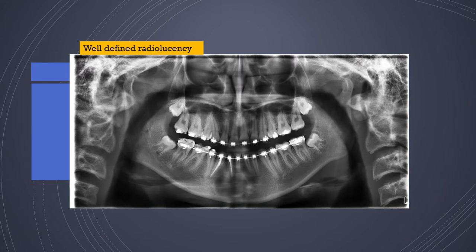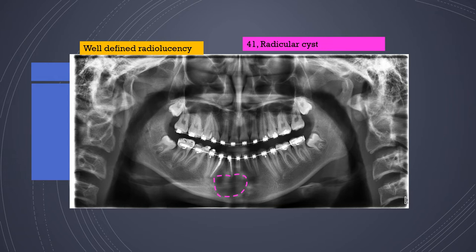Panoramic radiographs are excellent for patients indicated for orthodontics, both before and after treatment. But sometimes unexpected issues arise during treatment. For example, this is a case of non-vital anterior teeth, likely rendered non-vital due to force during orthodontic treatment, and you can also see that a cystic area has caused drifting of the root of the canine.